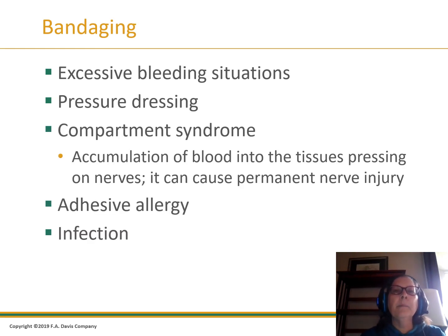Always maintain pressure or have a capable person apply pressure while you label the tubes. If the patient is incapable, you should apply pressure and apply Coban. Do not cut off the patient's circulation by wrapping it too tight. Some people will have a reaction to Band-Aid adhesive, and you should use paper tape or Coban wrap.